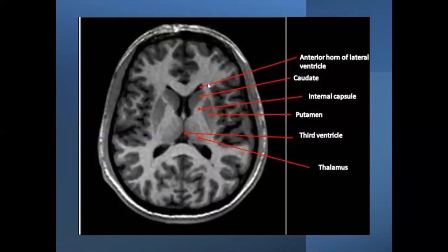On this MRI view you can see the lateral ventricle — the anterior or frontal horn — and the third ventricle. The hypointense area here is the caudate nucleus, and another nucleus visible is the thalamus. This is the internal capsule with its anterior limb, genu, and posterior limb. There are two structures here — the putamen and globus pallidus — which together constitute the lentiform nucleus. This is the external capsule lateral to the putamen, then the claustrum, and this is the insular cortex, the fifth lobe of the brain.